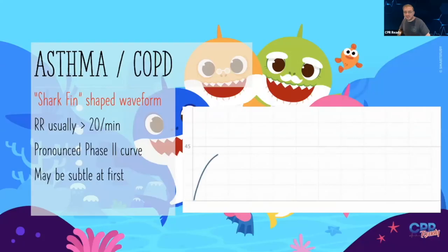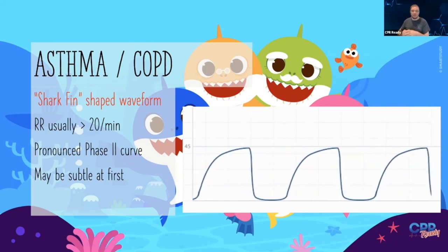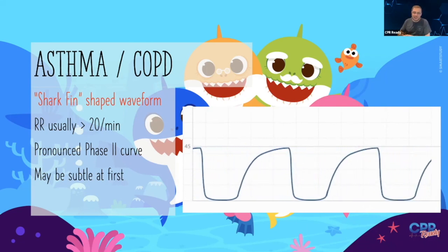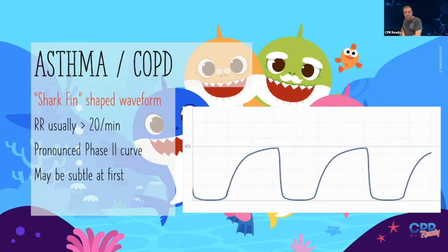And then this one's my favorite because this one's really satisfying. When you see it, it's so definitive and it can help guide your treatment. This is a great one to know. And I saw in the chat, somebody had already described something as looking like a shark fin.